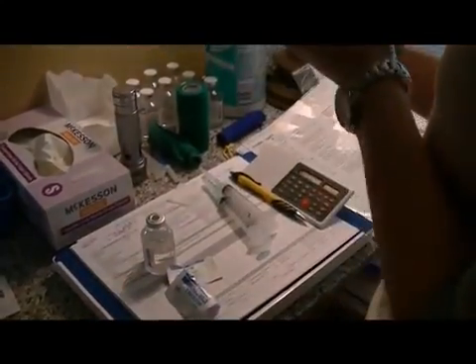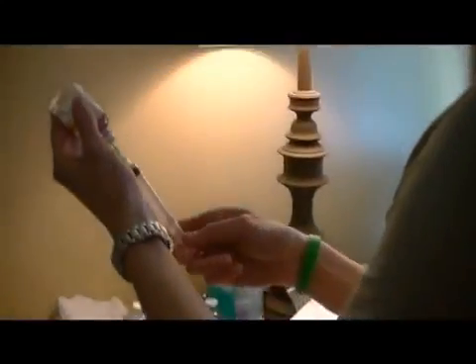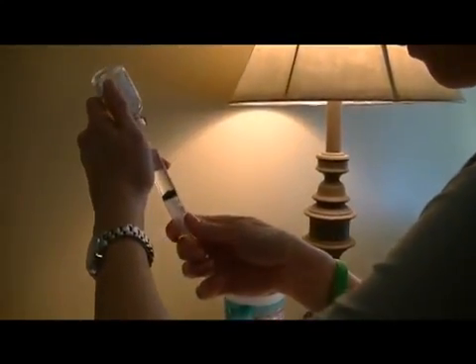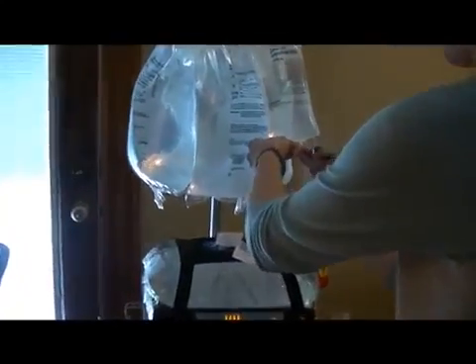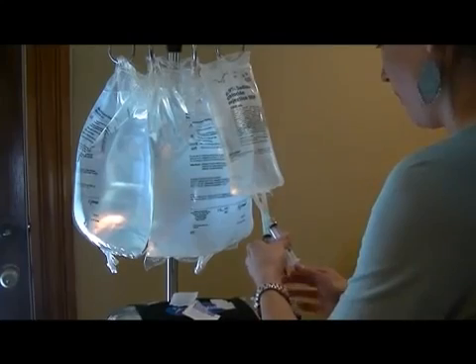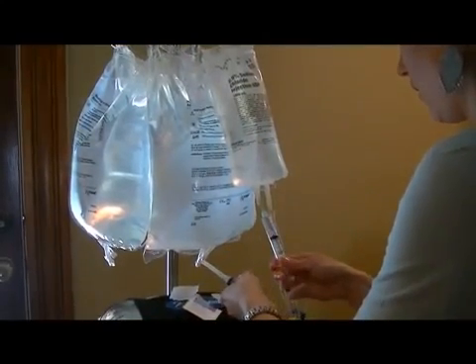Okay, and now we're just going to draw up the heparin that we put in to help so that he doesn't clot while he's on the machine. And we're just going to draw it up. Gets lots of bubbles in it. Okay. And we'll put it over here. Then we use saline to flush the lines whenever we stick him. And we have to draw it out of this bag. And we recap all the needles, even though you're not supposed to.